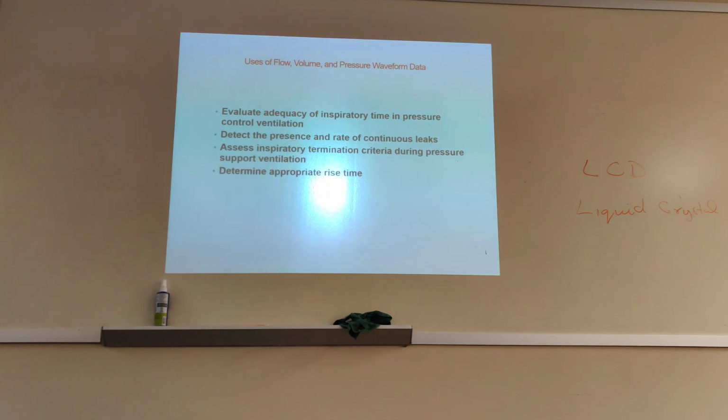evaluate adequacy of inspiratory time in pressure control ventilation, determine the presence and rate of continuous leak, assess inspiratory termination criteria during pressure support ventilation. And that is your expiratory sensitivity or the inspiratory cycle off. That's what terminates a pressure support breath. Determine appropriate rise time.